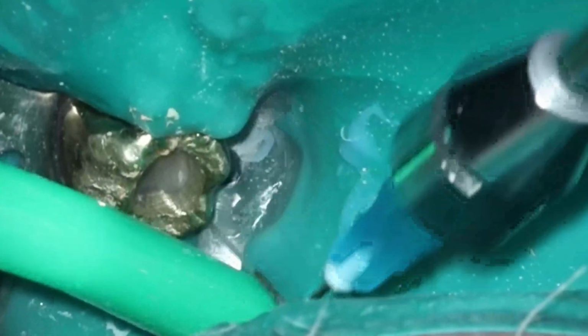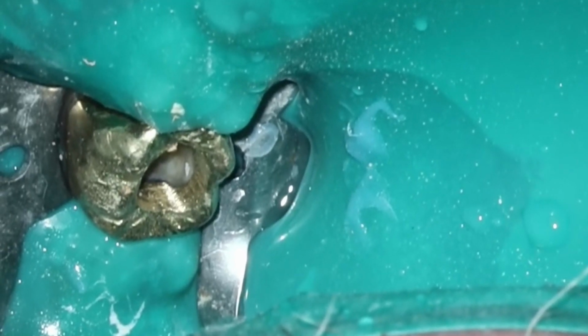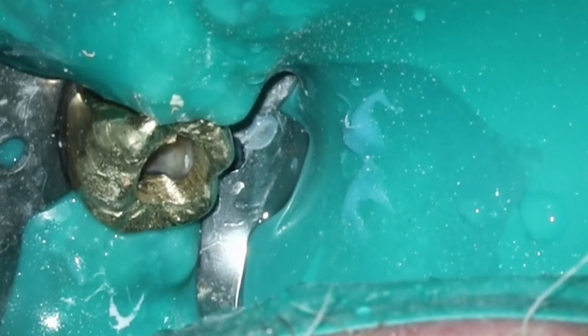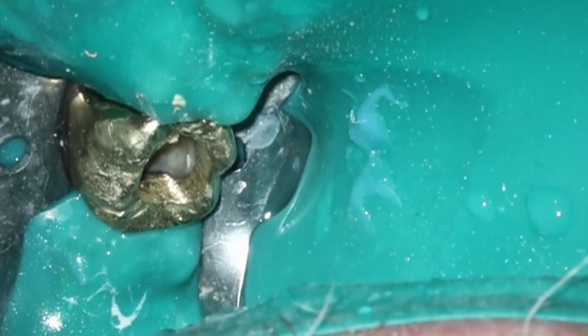So here we are finishing everything up. I don't know if I've talked about this before. I keep a scrubby brush in the isopropyl alcohol for when I do Gentle Wave. And it's really nice when you finish the case because you already have the scrubby brush built in. So it's really cool to get in there and get all that junk out of there, get everything looking perfect.